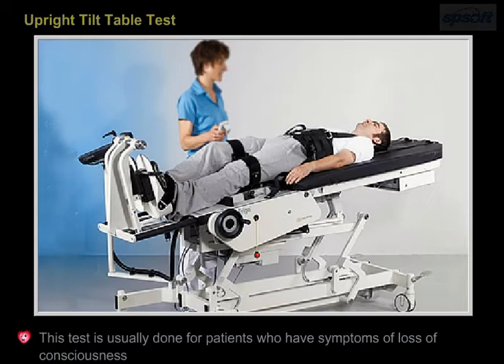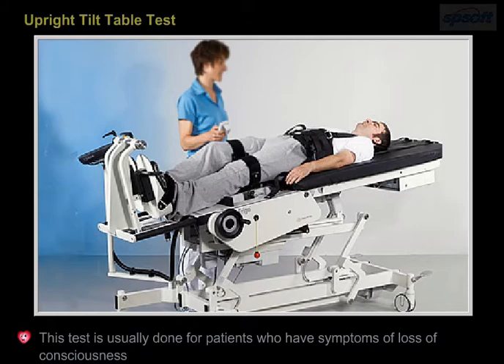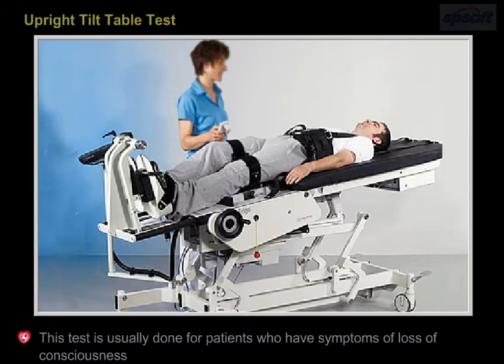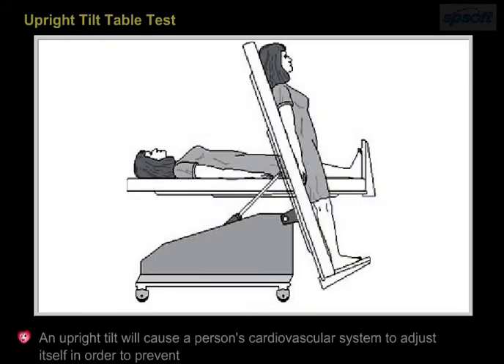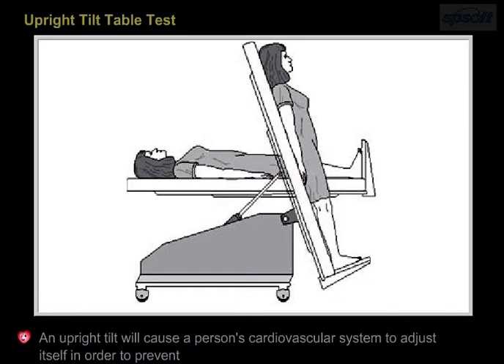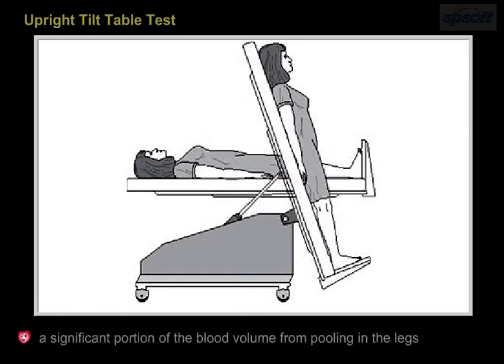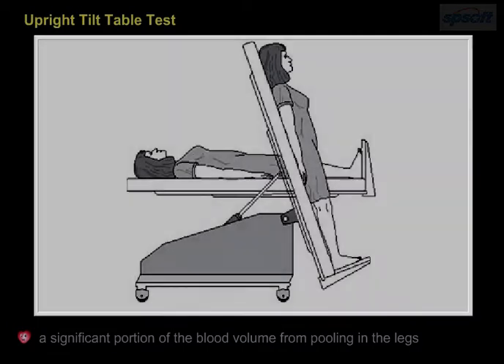Upright tilt table test. This test is usually done for patients who have symptoms of loss of consciousness. An upright tilt will cause a person's cardiovascular system to adjust itself in order to prevent a significant portion of the blood volume from pooling in the legs.